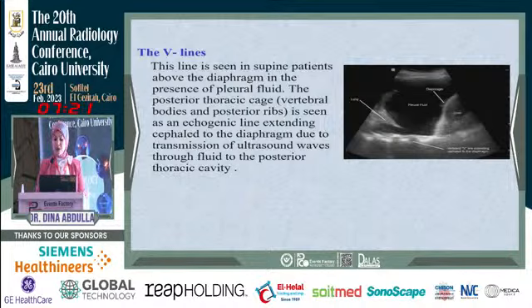The transhepatic examination with a convex probe placed subcostally from the right with a slight tilting in cranial direction shows the liver, diaphragm, as well as reflection of the liver above the diaphragm. Here is examination of the lateral aspect with a convex probe. In the mid portion of the right axillary line, we will see the diaphragm, the normal mobile lung shifting during inspiration into the costophrenic recess and covering the upper margin of the liver, which is the lung curtain as we described before.